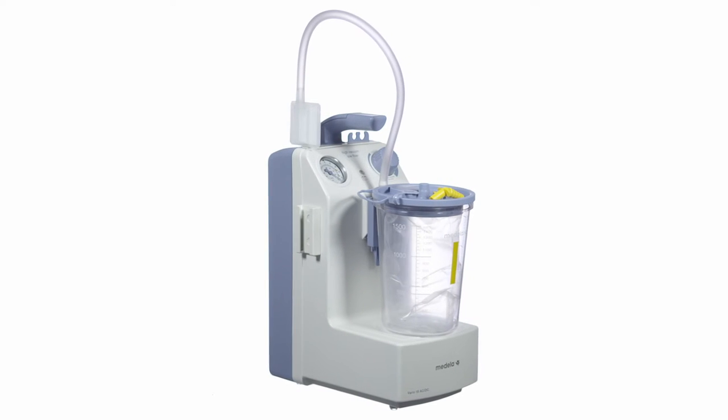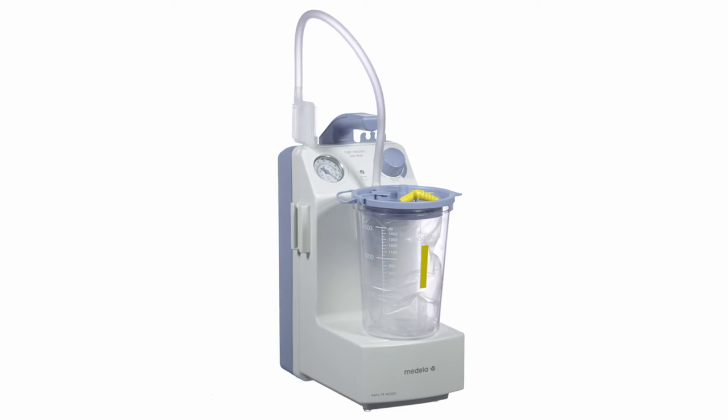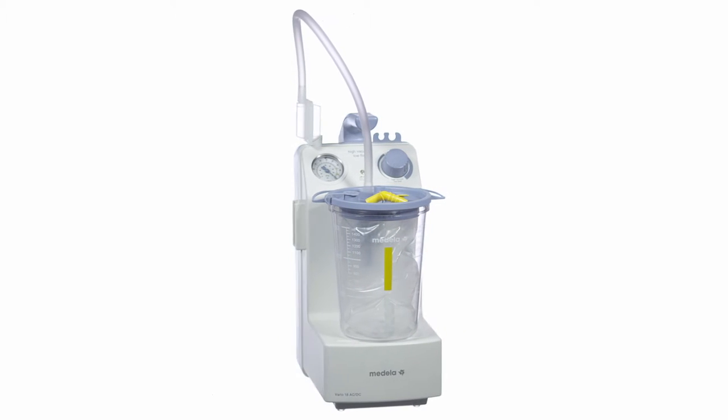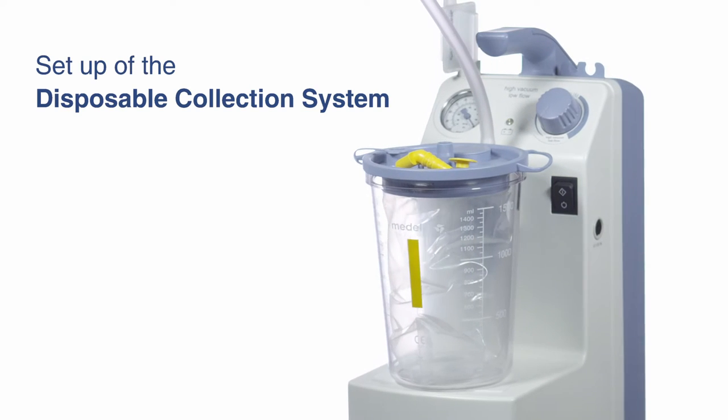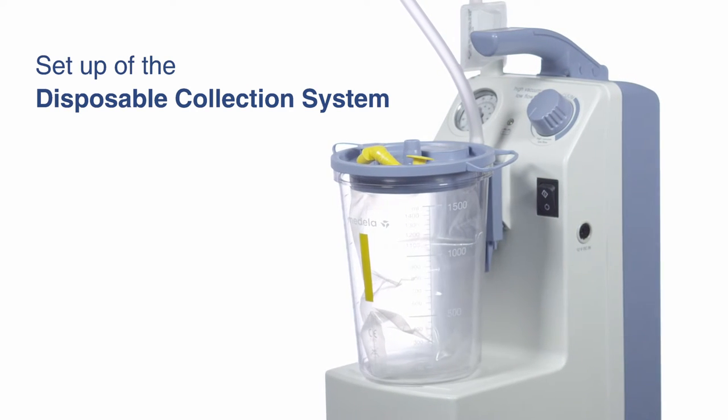The Medela Vario 18 is a lightweight battery-powered suction pump for daily use in outpatient clinics and private practice. This video shows how to set up the disposable collection system.